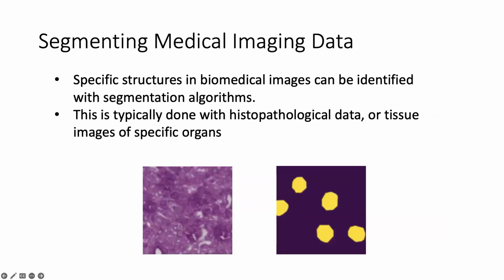This project deals with segmentation applied specifically to medical data. Specific structures within tissue images or histopathological images can be recognized. And this is very important because oftentimes segmentation can be more accurate and efficient than pathologists.